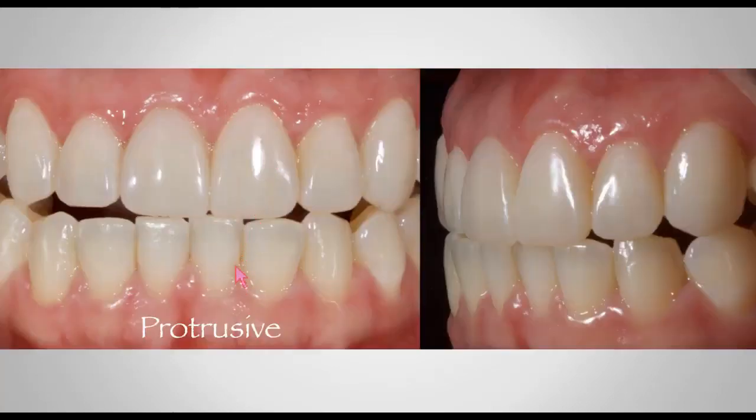Now I'm checking the occlusion, making sure that there's disocclusion of all posterior teeth, that there are no interferences in protrusive movements, and this is a frontal view, and you can see the same thing on a side view. We're going canine guidance, just to make sure that all the occlusion is there so that there's no chipping or fracturing of our prototypes.